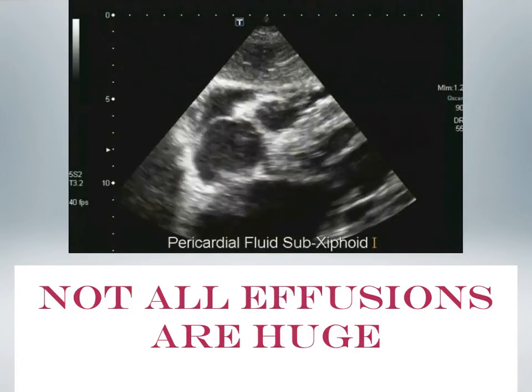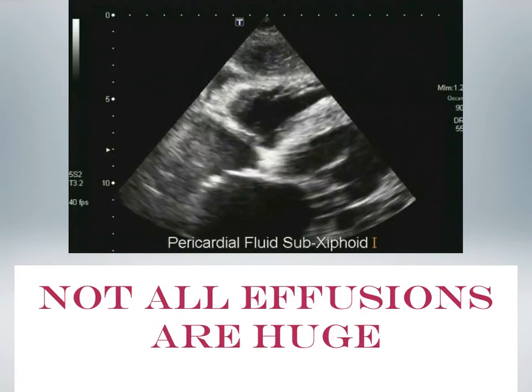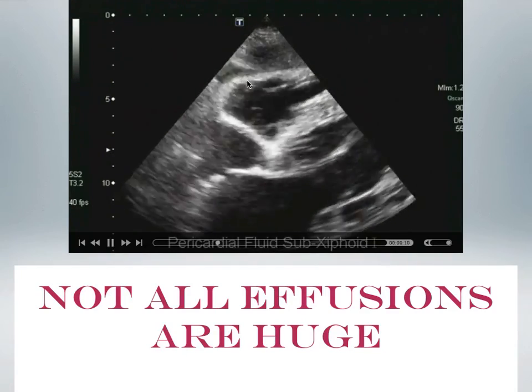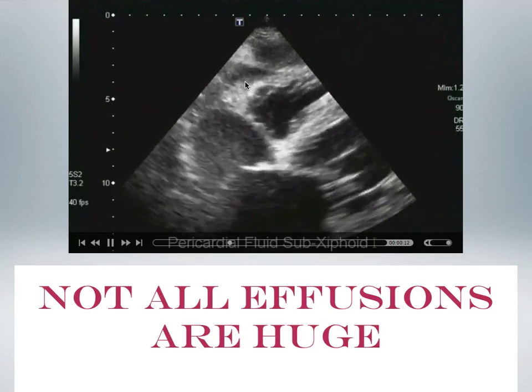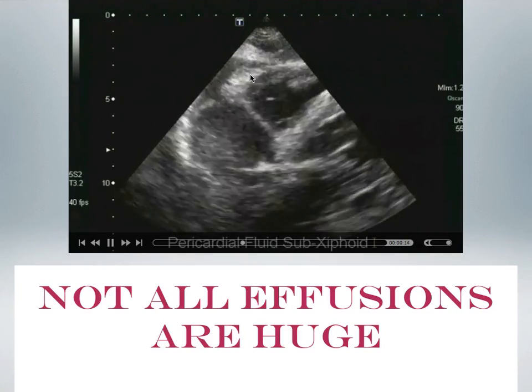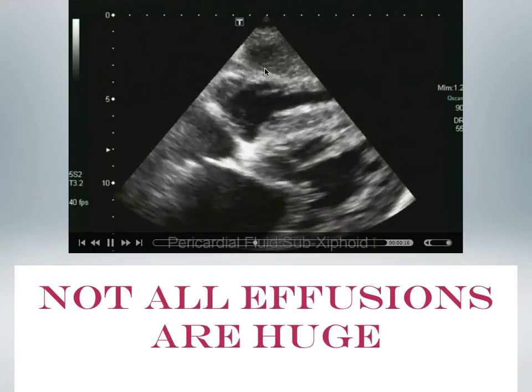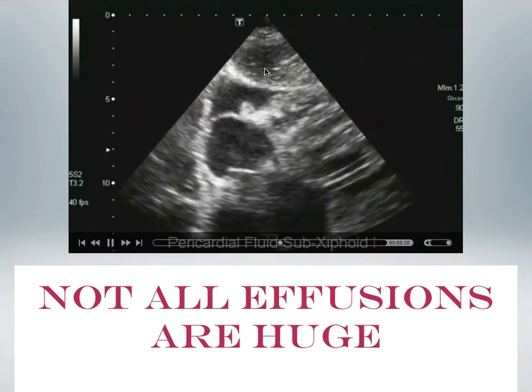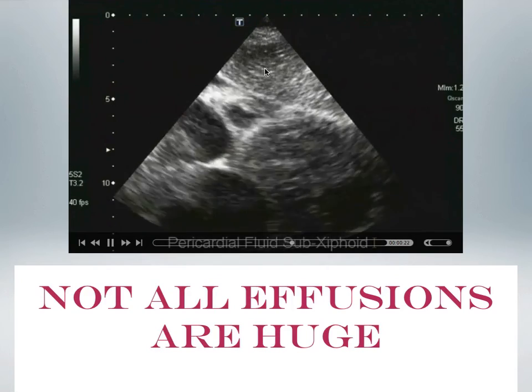And as a reminder, not all effusions are huge. So here's a small effusion. And this again, subcostal or subxiphoid. We see the liver on top. And an effusion is a normal finding, as long as it's small.